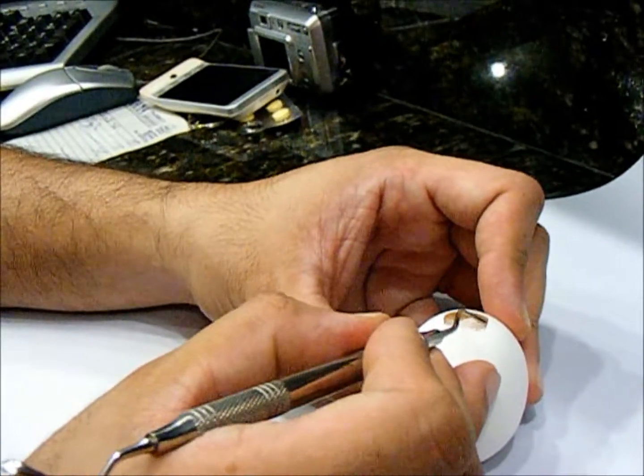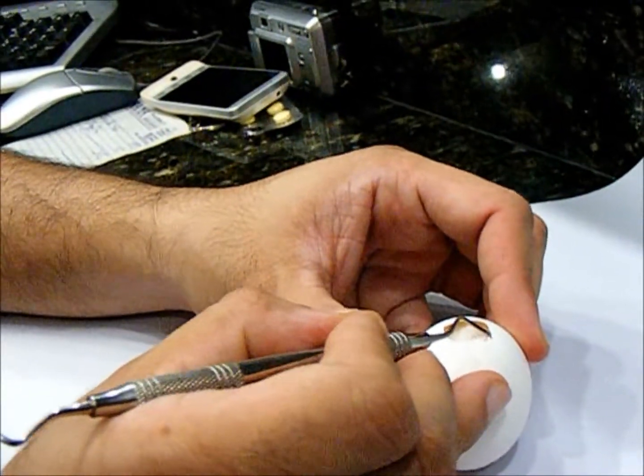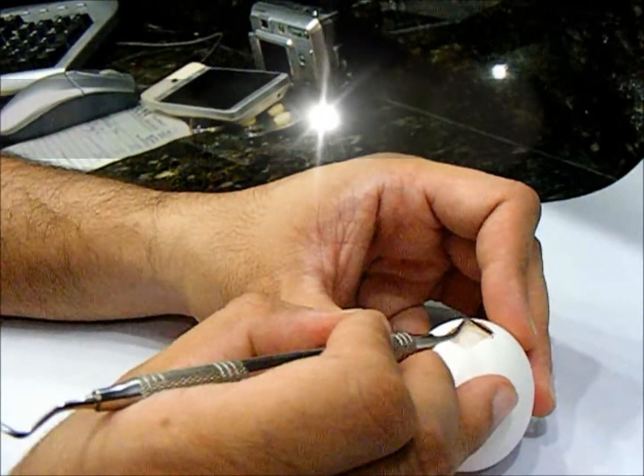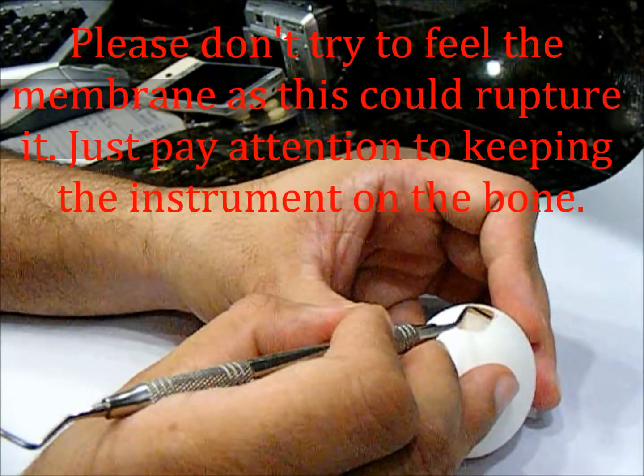It is the quick movement that is going to rupture the membrane, not the slow movement. If you keep doing it slowly, you should be able to peel off any large sinus without complication.